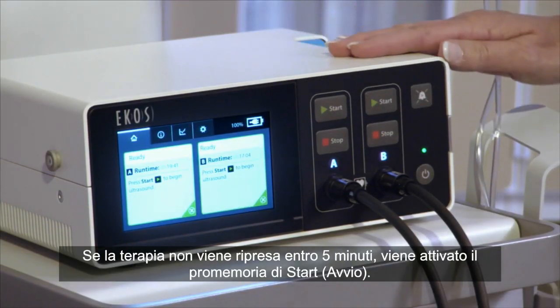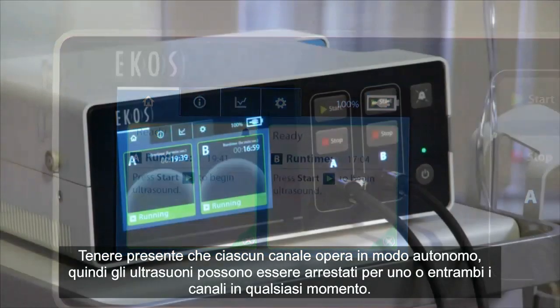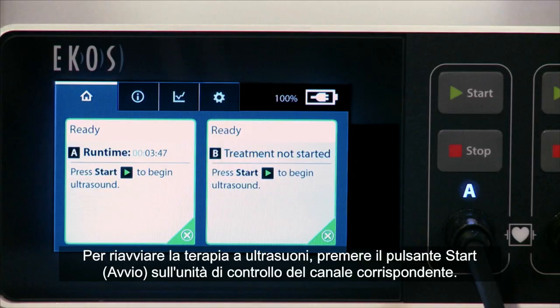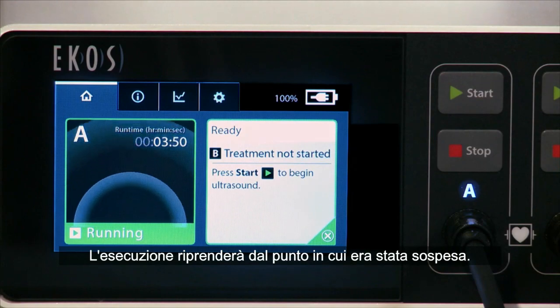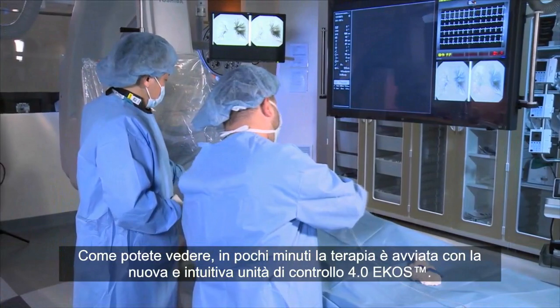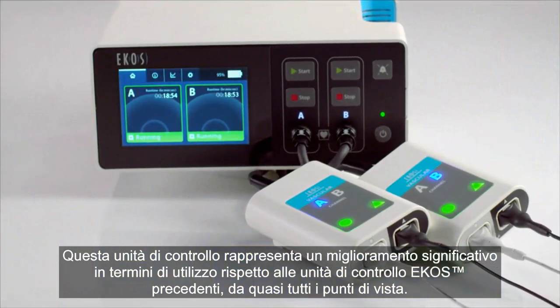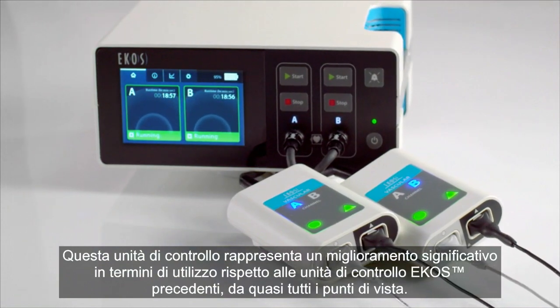If therapy is not resumed within 5 minutes, the Start reminder activates. Note that each channel operates independently, so the ultrasound can be stopped for one or both channels at any time. To restart the ultrasound therapy, press the Start button on the control unit for the corresponding channel. The runtime will resume from the time when it was stopped. As you can see, in just a few minutes we're up and running with the new intuitive EKOS Control Unit 4.0. This control unit is a significant improvement in usability over previous EKOS control units in almost every way.